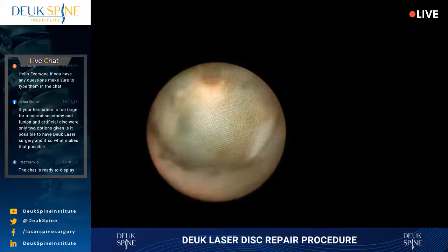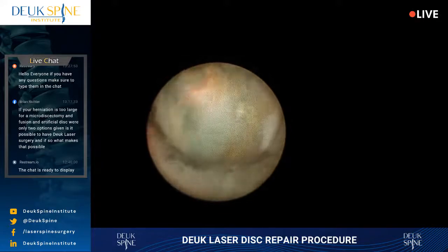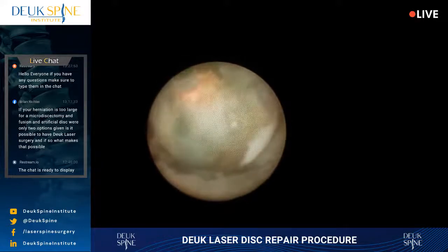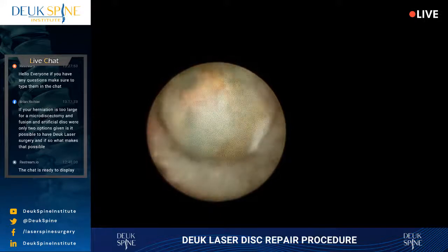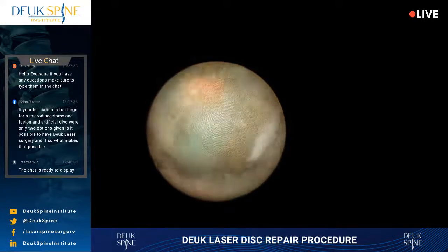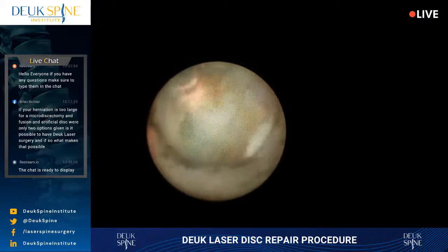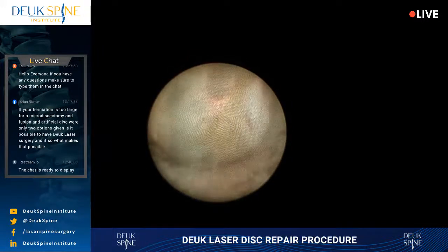That is on her right side. That's probably causing a lot of her arm symptoms right there. That thing is massive, and it's scarred right here. It's stuck. So I'm actually breaking up the scar tissue with the laser. That thing is going to be free soon, and it's going to pop out. It's going to be really cool. And it's sitting right on the nerve root, so I just got to be careful not to go too deep.